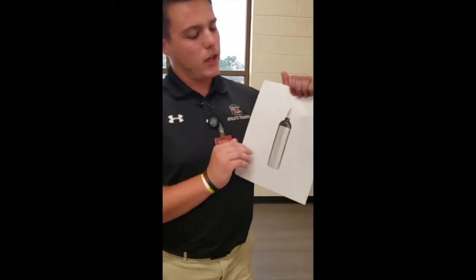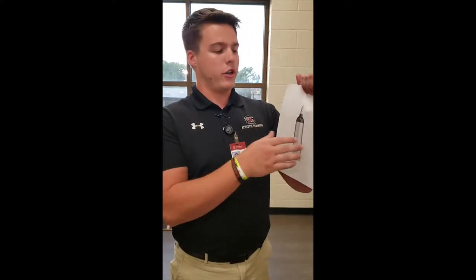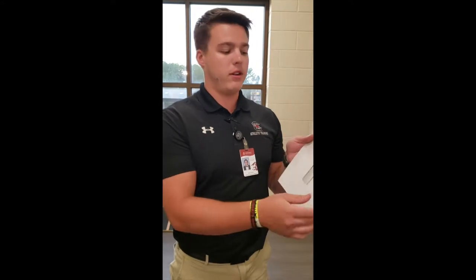So, you're going to have your oxygen tank, and what you're going to do is apply the valve to the oxygen tank. You're going to tighten that on, and then you're going to check first to make sure that you have enough oxygen in the tank to be able to supply to somebody.